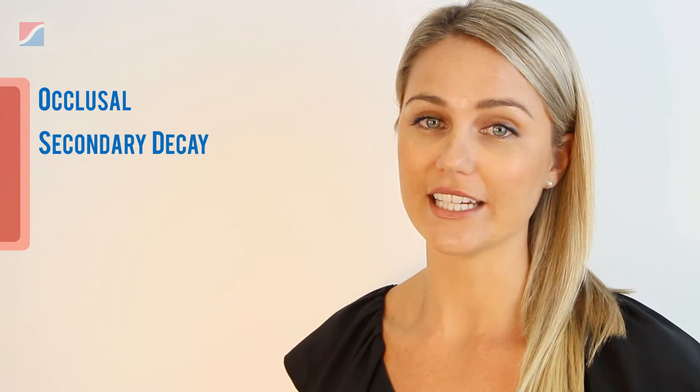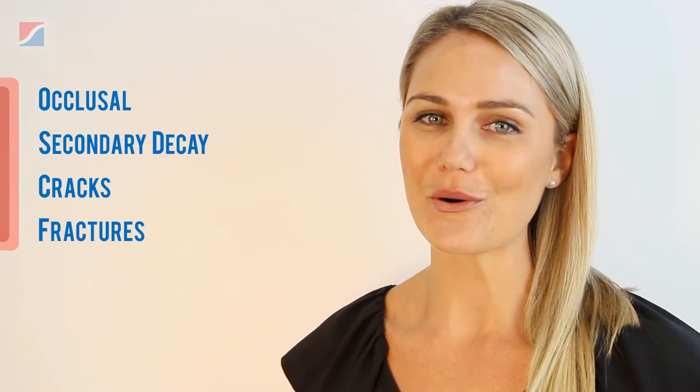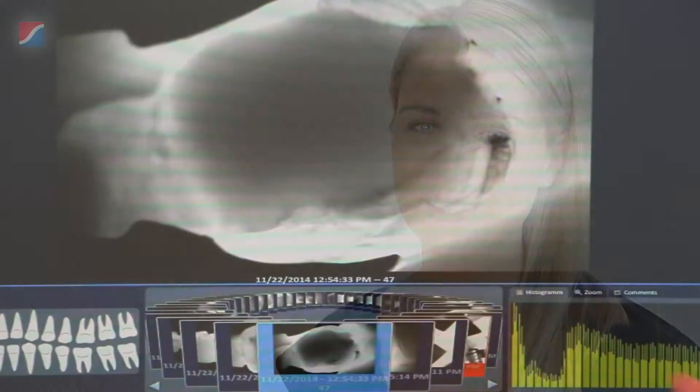Essentially, it scans the patient in a matter of minutes, identifying a range of occlusal, secondary decay, cracks and fractures, much more than your conventional type of diagnostic tool.